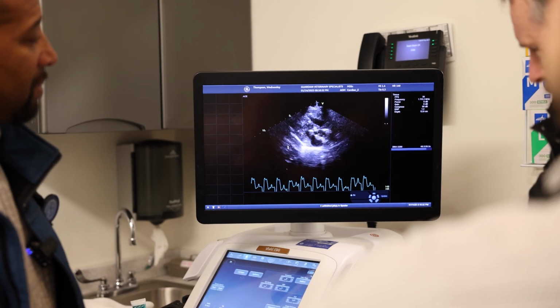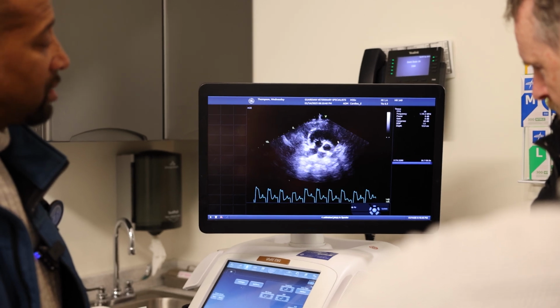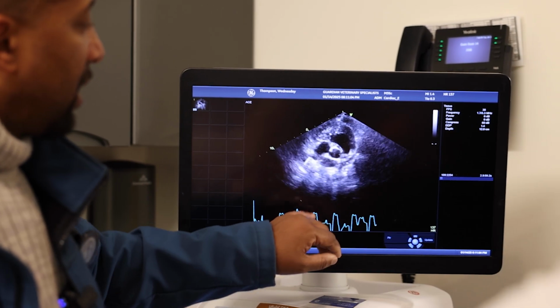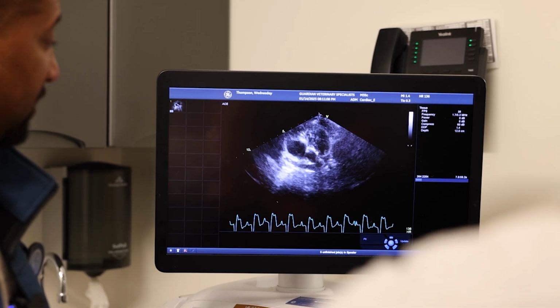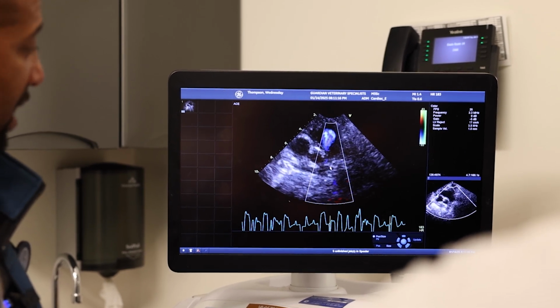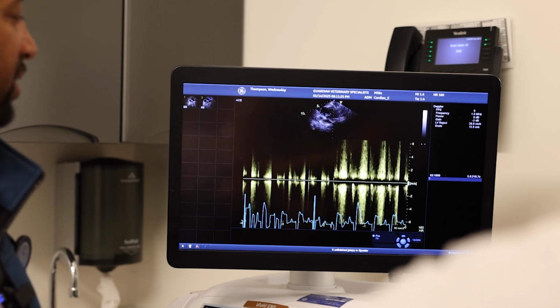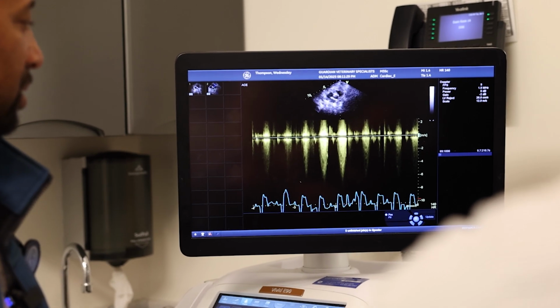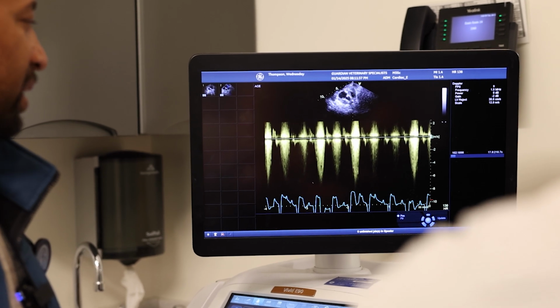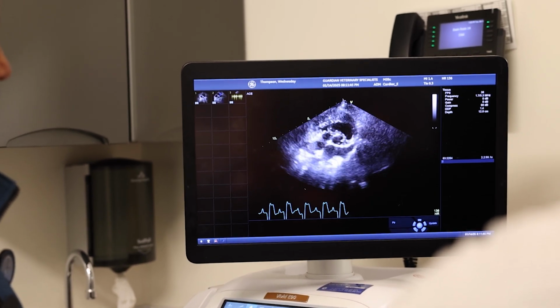Blood goes out to the body, gets returned to the right side of the heart, through our right atrium, tricuspid valve, right ventricle, and gets pushed out to the lungs. What I'm seeing is the right side of the heart has gotten bigger. It's gotten bigger because it has to work harder to get blood through this tight spot here. That's where the valvuloplasty has been taking place. They're trying to get blood through that little narrow pathway there. We look and see how much pressure the heart is having to generate to get through that tight spot. Normal is about 0, severe is anything over 80, and you look like you're coming pretty close to 200. I'll get an exact measurement on that. But that's why she's collapsing.